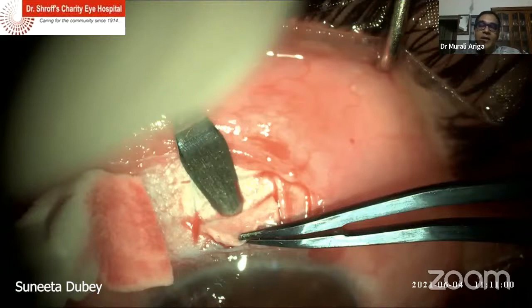You must at least have 1 or 2 millimeters of conjunctiva on either side of the base of the flap. You should definitely have at least 1 or 2 millimeters on either side.